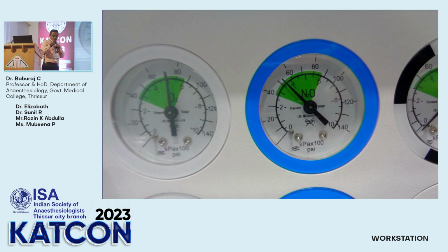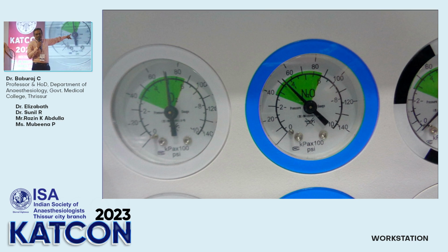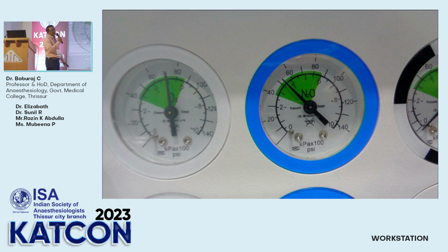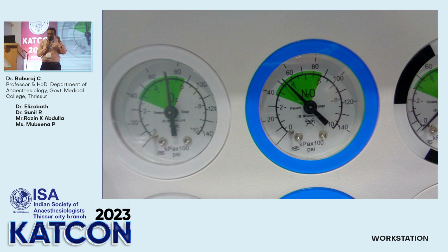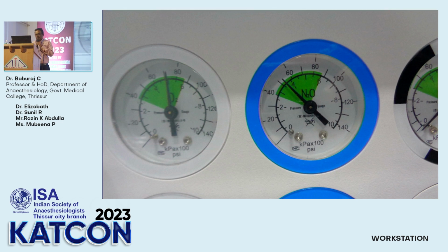And always make sure, it is your duty to make sure that the gas pressure is in the green area. That is between about 2.5 to 5 or 6. If it is less than that, the working pressure is not adequate and your anesthesia workstation will not function. So make sure the line pressure is in that range.